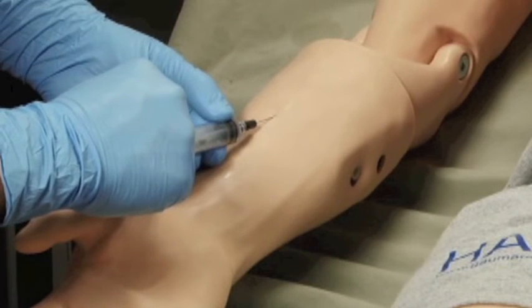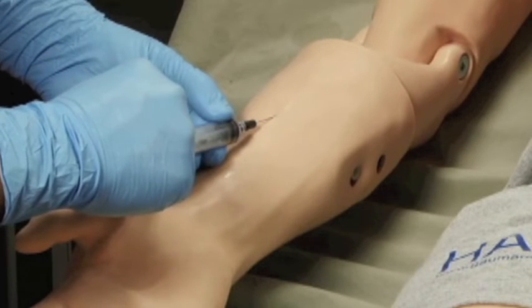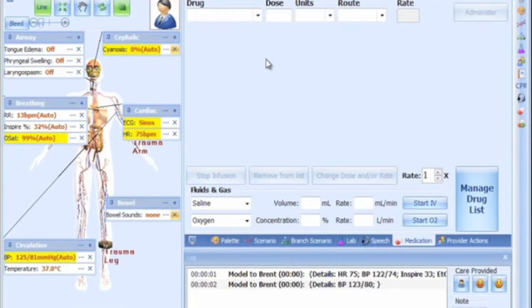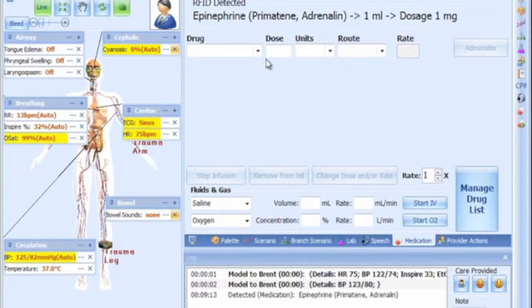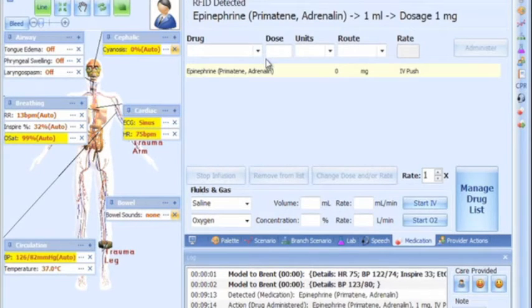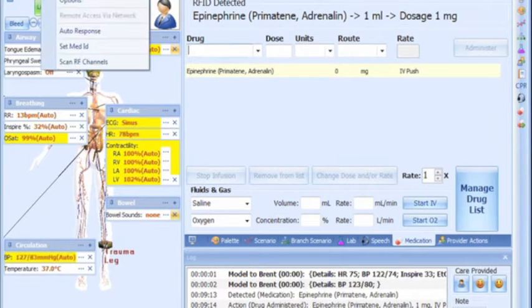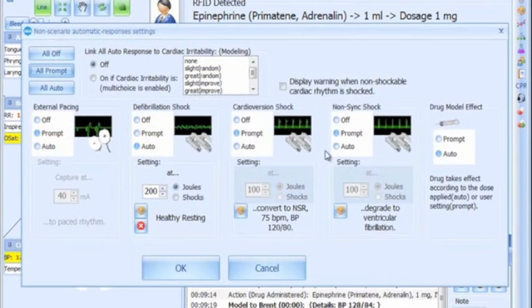When using the system for IV infusion, GOMARD strongly recommends that the drainage hose be connected. As the drug is delivered, the software will detect which drug is being given and will calculate the dosage administered. The software can either be set to auto mode, where the drug is applied directly into the model, or it can be set to prompt the instructor, who decides whether the drug gets administered or not.